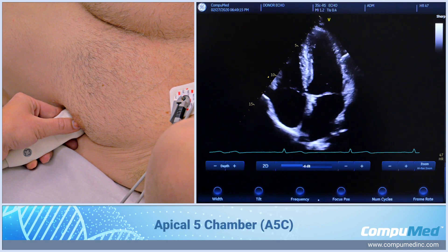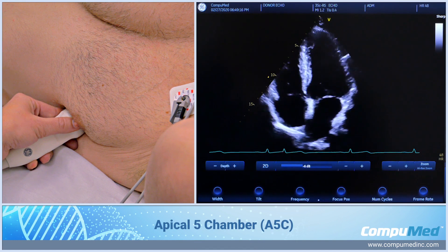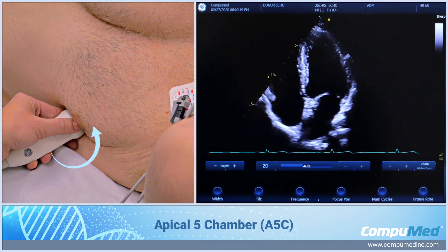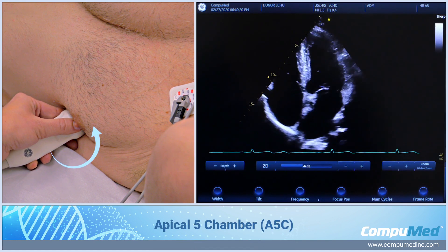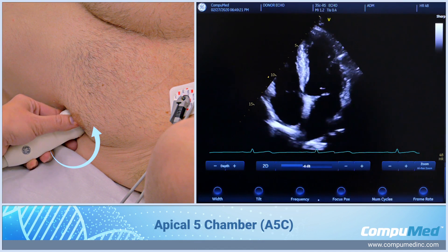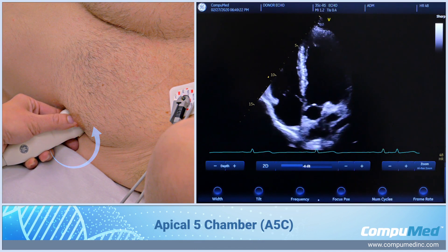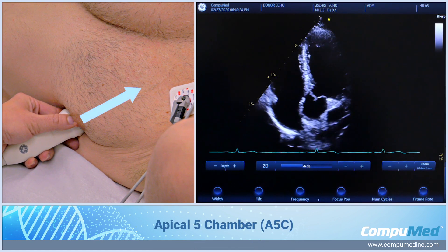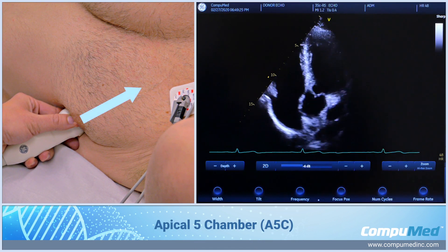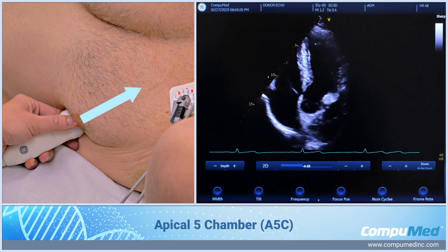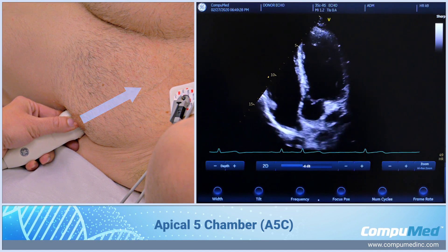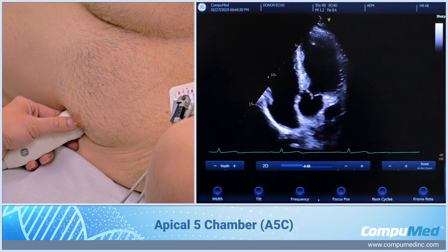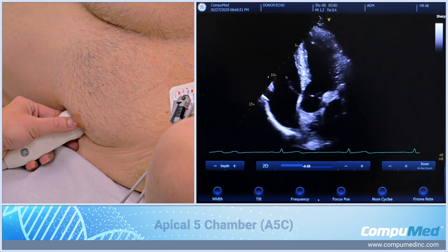To move to an apical 5-chamber, all I'm going to do is rotate the transducer counterclockwise to around 2 o'clock and angle slightly anterior towards his head. This allows us to get a really good parallel to flow for Doppler interrogation of the aortic valve.